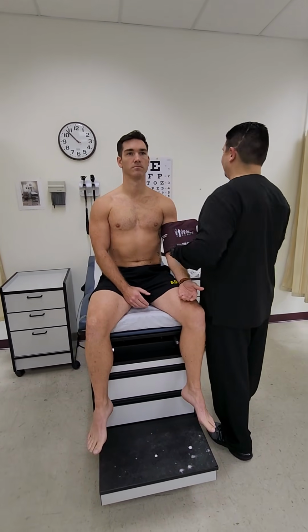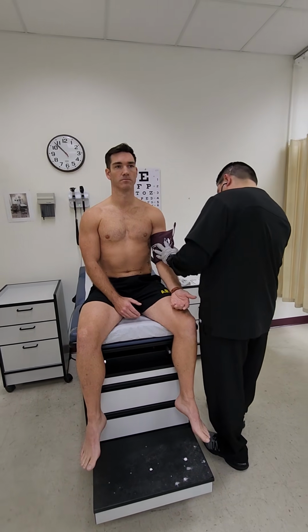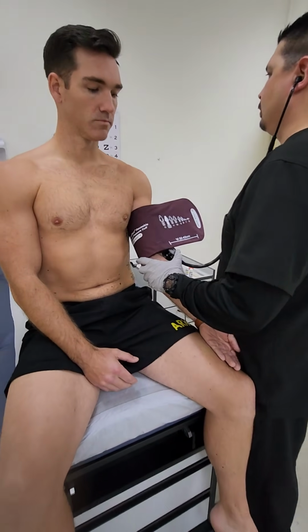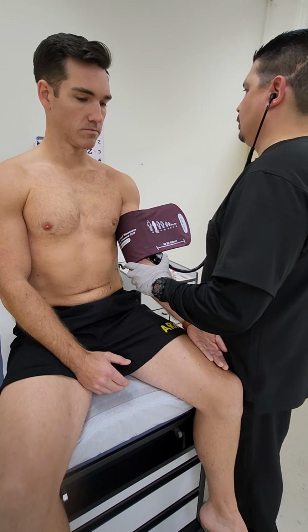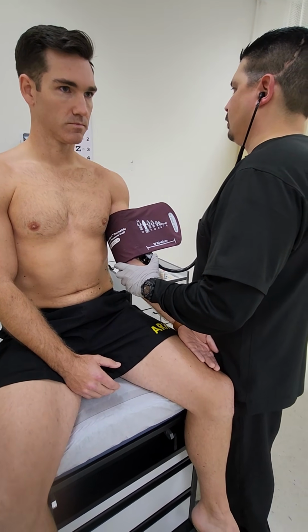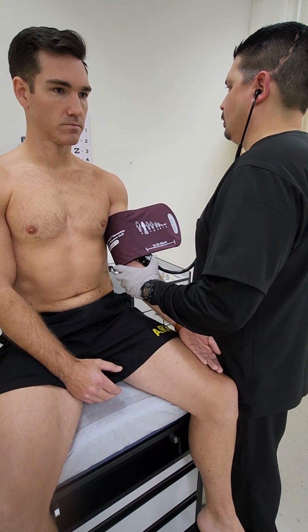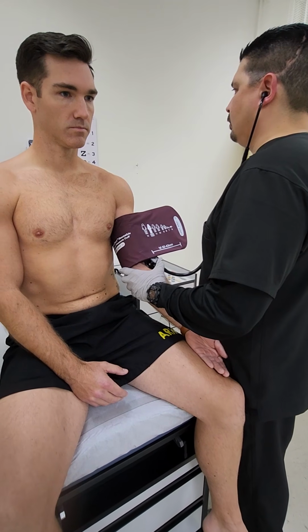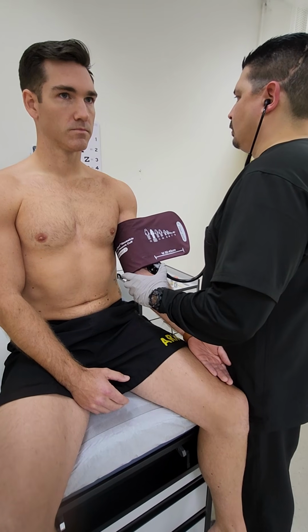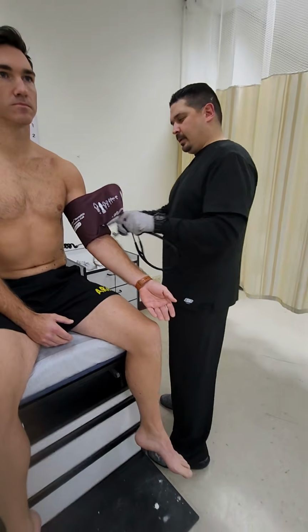Should use this, huh? All right, 118/72. That's a good one.